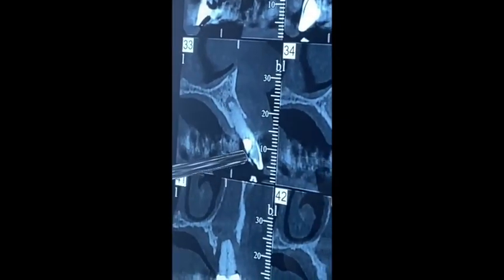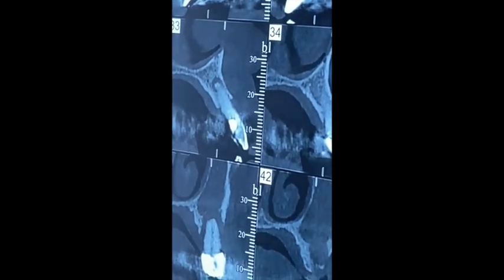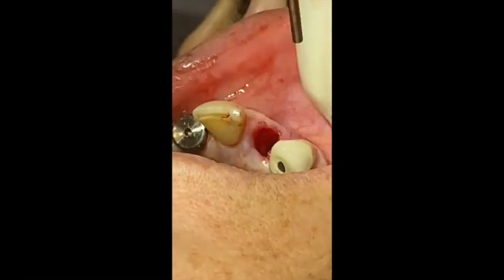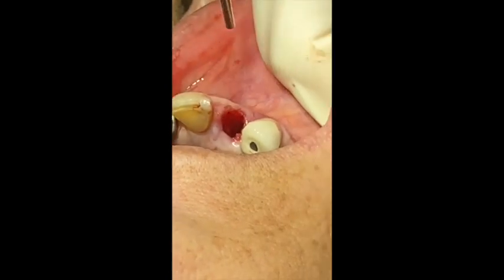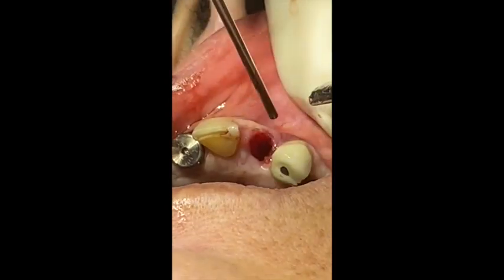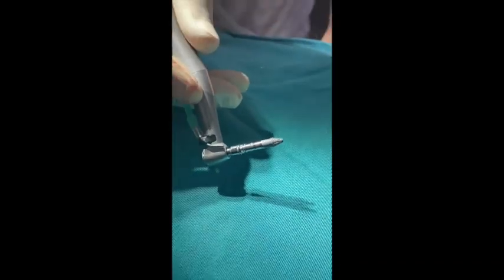This is position number 22. We've extracted the 22, removed the periapical granuloma, and we have a big hole here. If you put a 4mm diameter implant, you'll have no stability. You need to put a 5mm, but for a lateral we don't want a 5mm. So we'll put something which is 4mm and 5mm — we've got 11.5mm length.